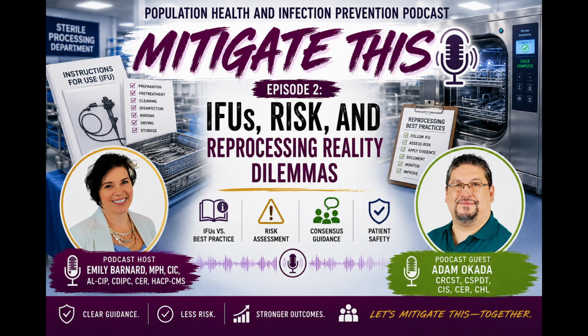I still think it's helpful for specific, very complex devices. Flexible scopes are some of those that really classify as a very complex device. If you look at the reprocessing instructions for a flexible scope, a lot of them are 175, 180, 200 pages long. It's really going to be hard to pull that up and go through the whole thing as you're processing every scope. So that's why they have those wall charts for some of the more complex devices like flexible scopes. I'd also recommend arthroscopic shavers. Robotics are a good one to have on the wall.